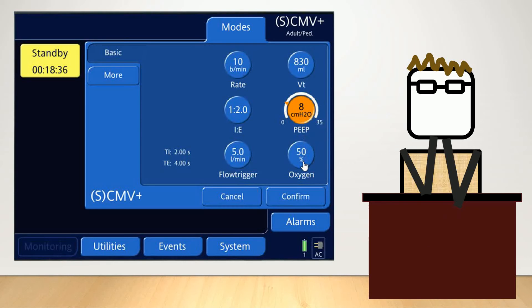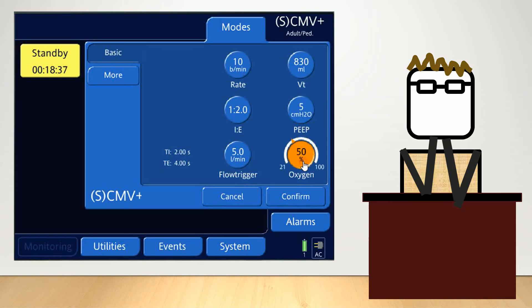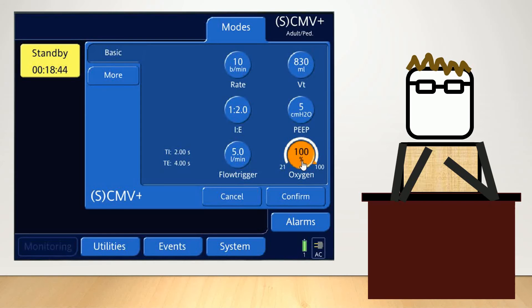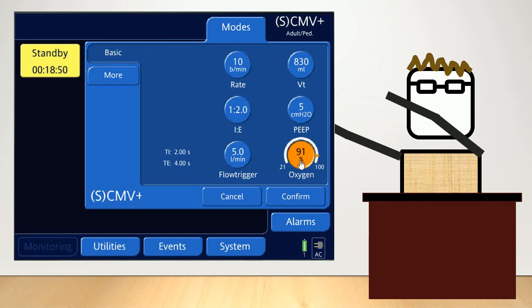Finally, you need to set your FiO2. Obviously, 21% is room air and 100% is complete oxygen.